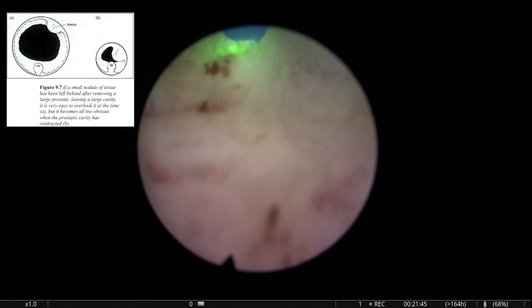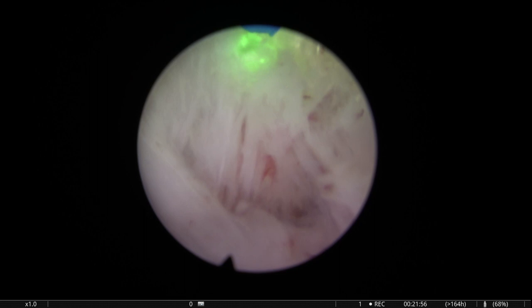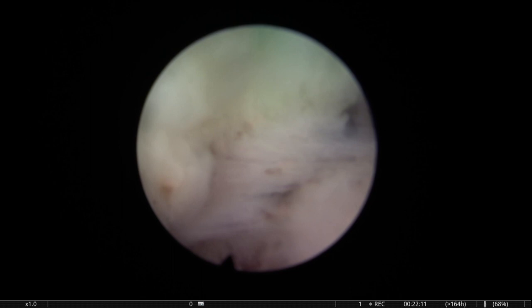So that's why I insist. And I have seen many cases where one of these nodules caused problems. I remember one patient, I did an enucleation. We took out 100 grams, but we left a small apical nodule. And he came back to me several months later with a catheter, and he said, I went to another colleague, and he did a cystoscopy. He said, you were not operated properly.